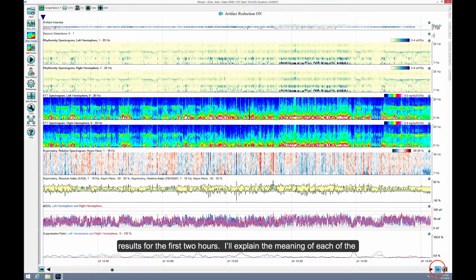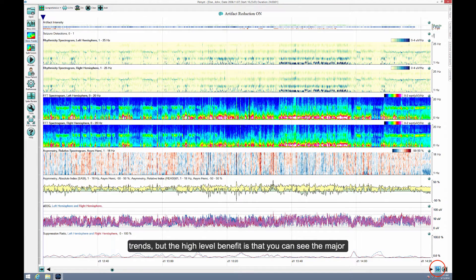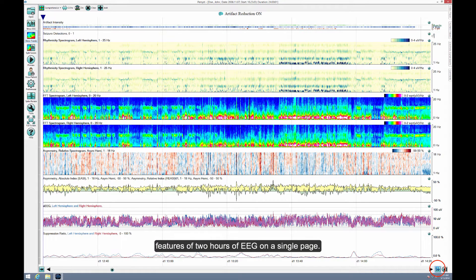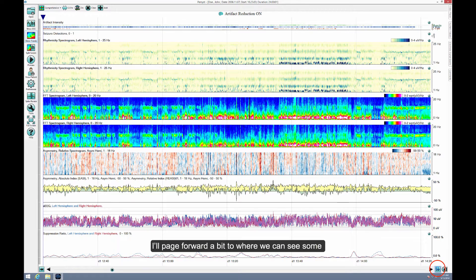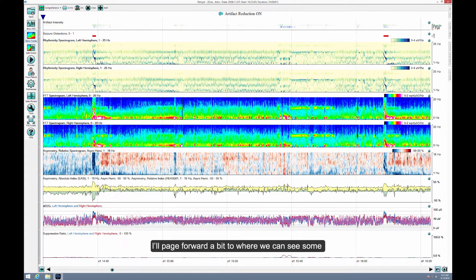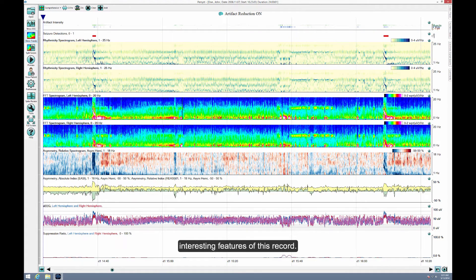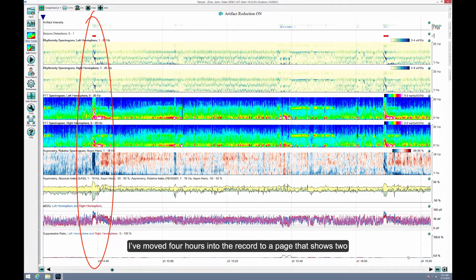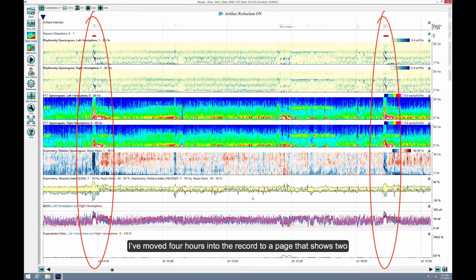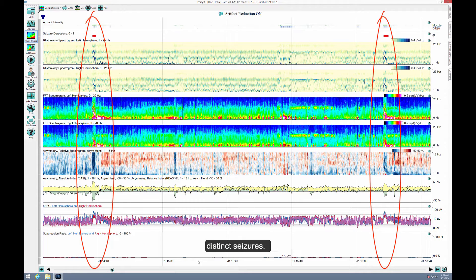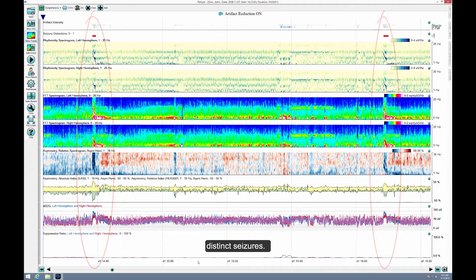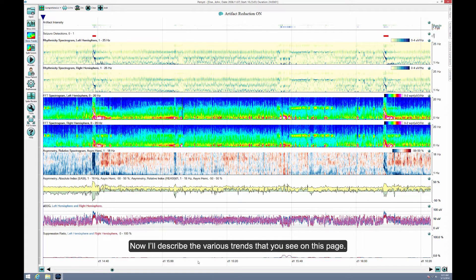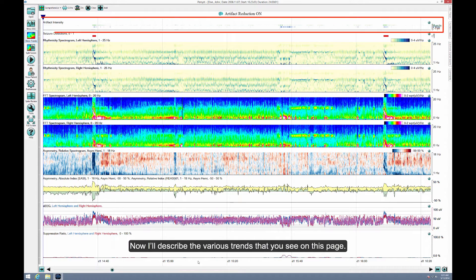I'll explain the meaning of each of the trends, but the high-level benefit is that you can see major features of two hours of EEG on a single page. I'll page forward a bit to where you can see some interesting features of this record. I've moved four hours into the record to a page that shows two distinct seizures. Now I'll describe the various trends that you see on this page.